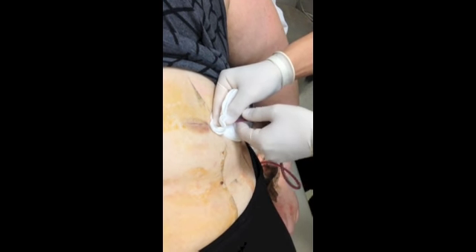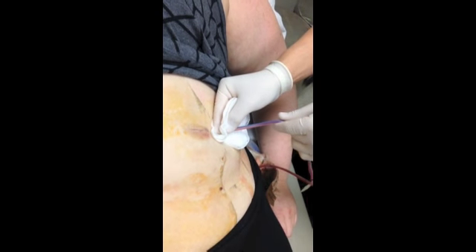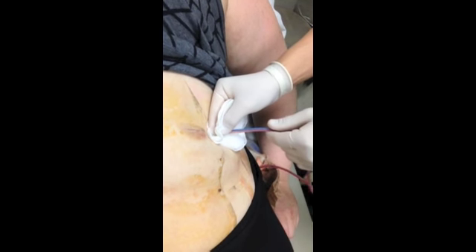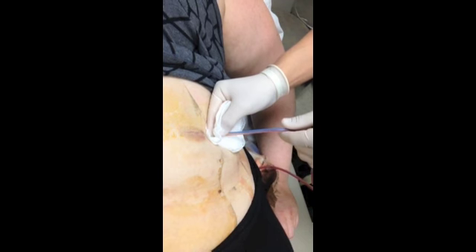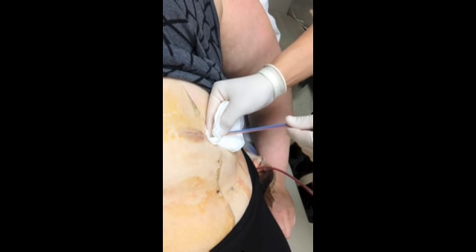Keep concentrating on the deep breath, it's not painful, you just feel a weird sensation. Moving — deep breath — concentrate on the breathing. I don't hear you. And then perfect.